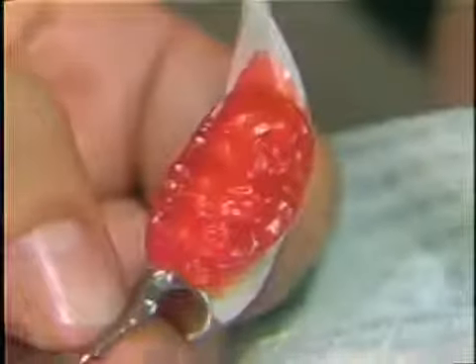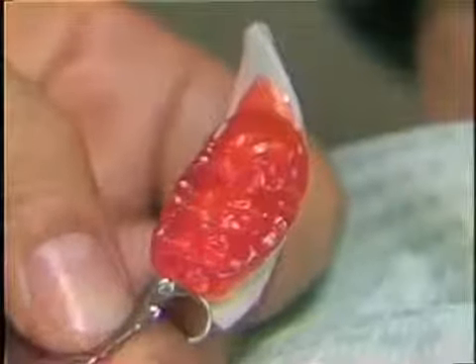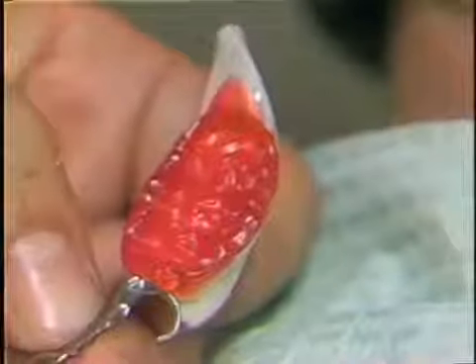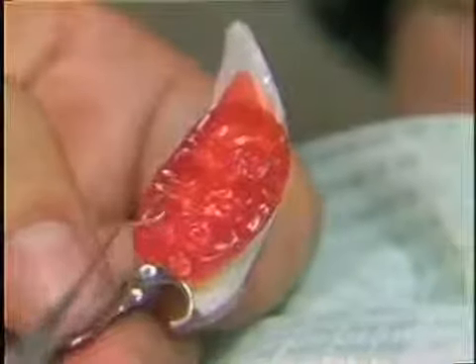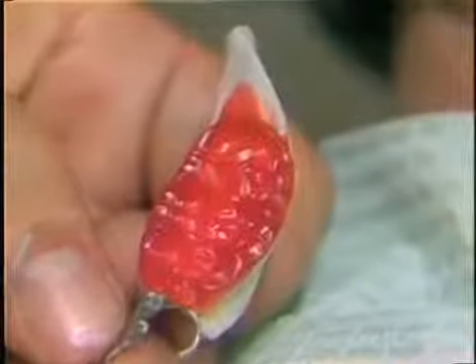Now, as I said before, this patient has somewhat of a steep tooth guidance, and so the wax isn't going to be pushed or leveled out laterally quite as much as if she had a flat incisal guidance, or less of an incisal or tooth guidance. The other thing I want to mention about the functionally generated record is that it gives you balanced occlusion.